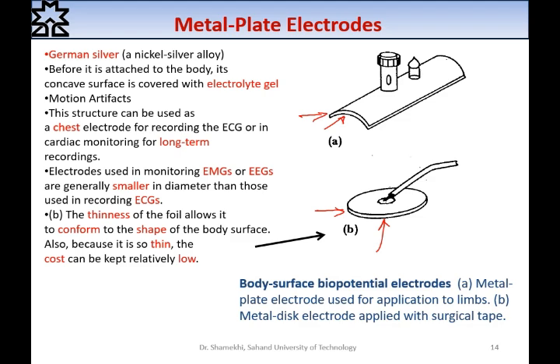Fixation means using some strap, some bands, something like that, to reduce the motion artifact. Remember that. Polarizable electrodes, motion artifact.